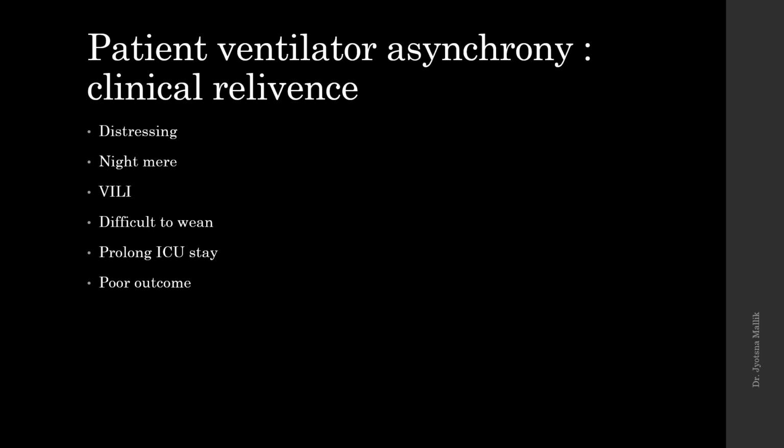So, what is patient ventilator asynchrony and what is its relevance in the clinical scenario? Whenever we put a patient on a ventilator, there will be an interaction between the patient and the ventilator. If the ventilator is not meeting the patient's demands, suppose the patient is inhaling and the ventilator is opening the exhalation valve and letting the patient exhale, or the patient wants to exhale and at that time the ventilator is giving a positive breath, that means there is a difference in the interaction between the patient and the ventilator. So there is an asynchrony between these two. That will not be helpful for the patient.